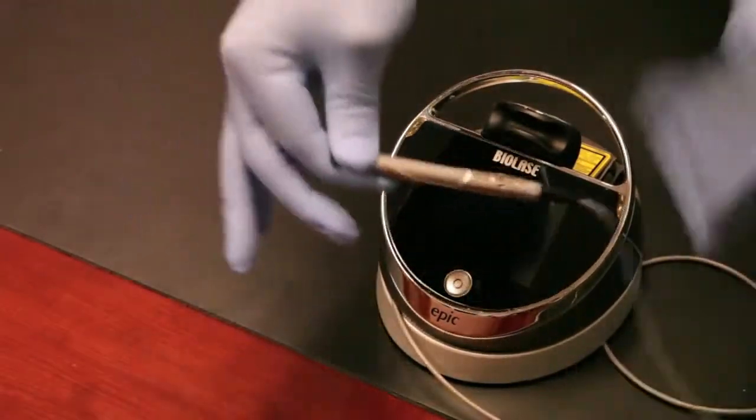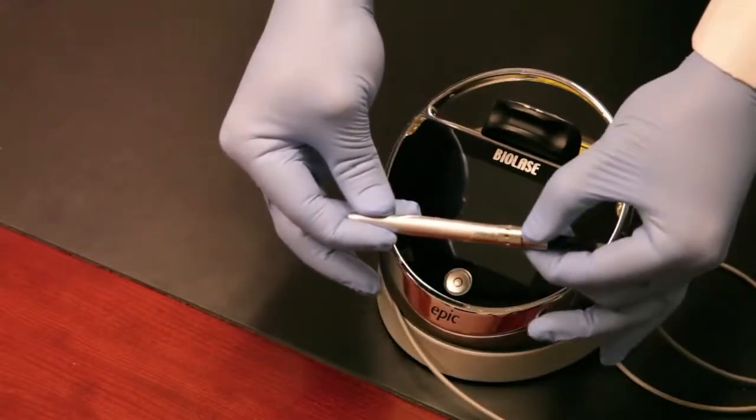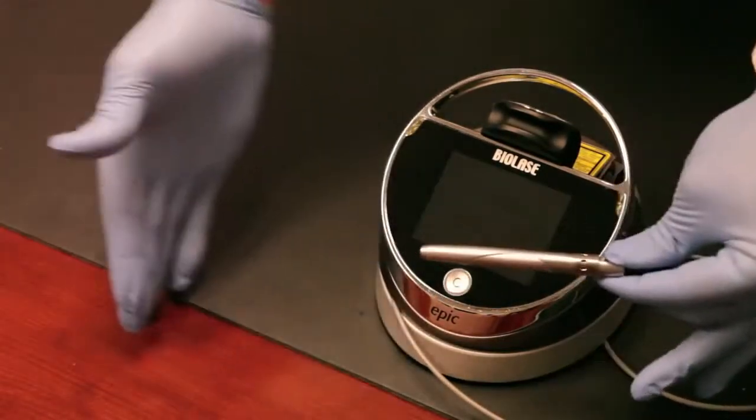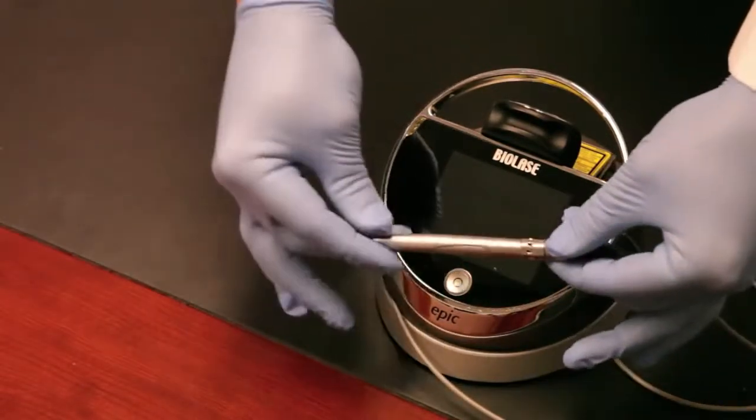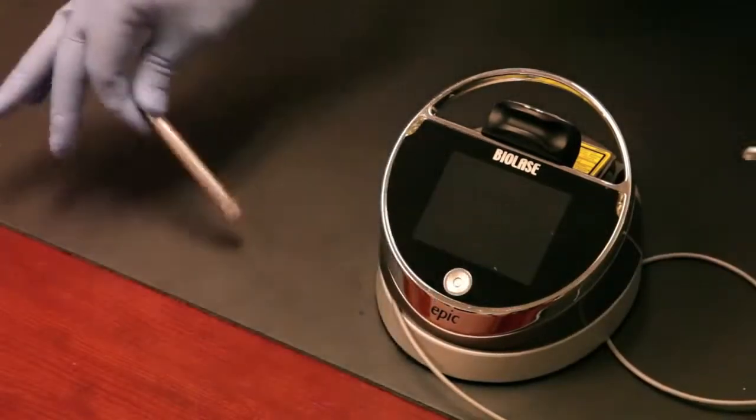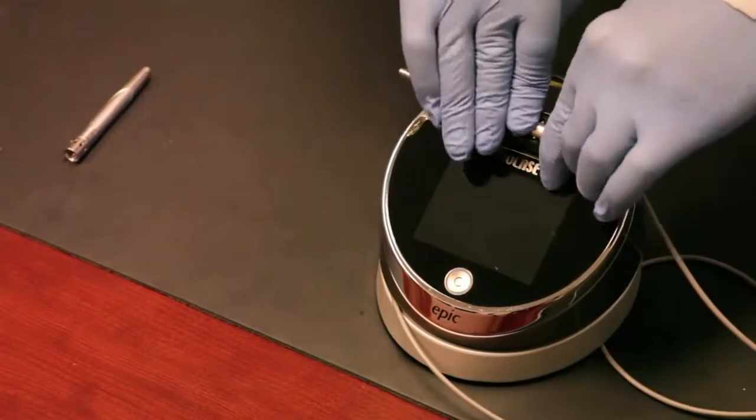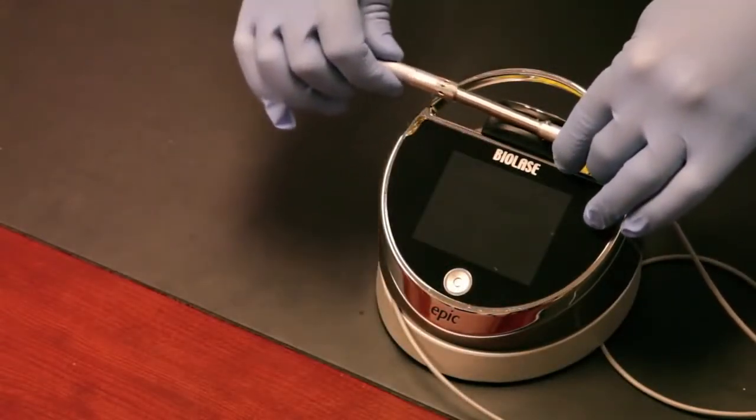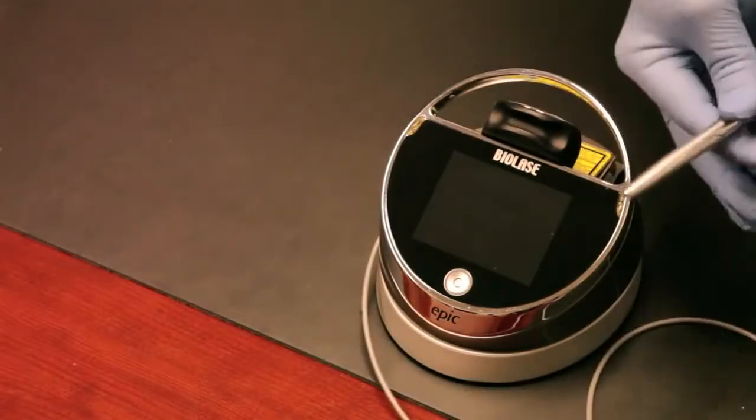To remove the handpiece or install it, there's two little buttons. You can see it slides right off. Put it on, take it off, put it on, squeeze the two buttons off it comes. This is what you'll autoclave. This is what you'll wipe down after use. You'll put this away on the handpiece and this goes into the autoclave unit. Very easy to take down and set up.